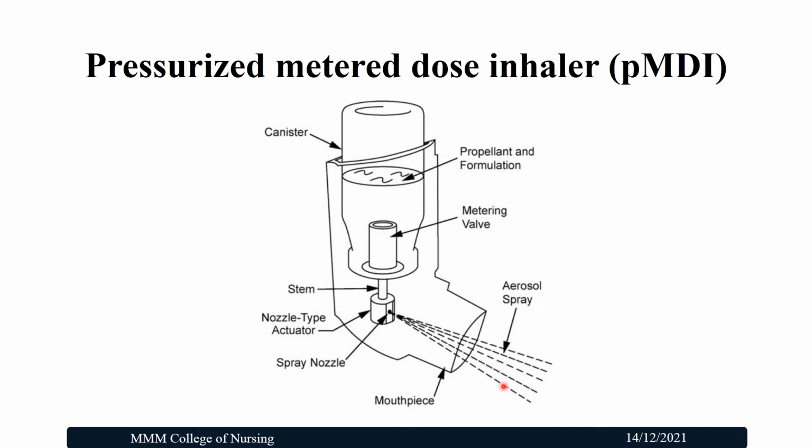The propellant provides the force to generate the aerosol cloud and is also the medium in which the active components must be suspended or dissolved. So upon application, a short burst of aerosol medicine will be released, which will enter into the lungs.